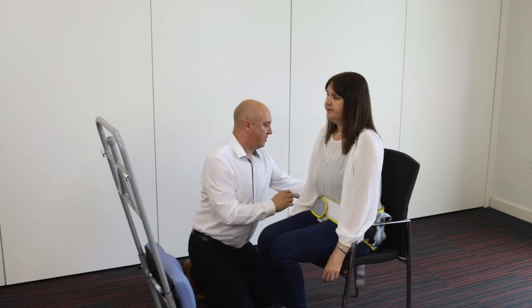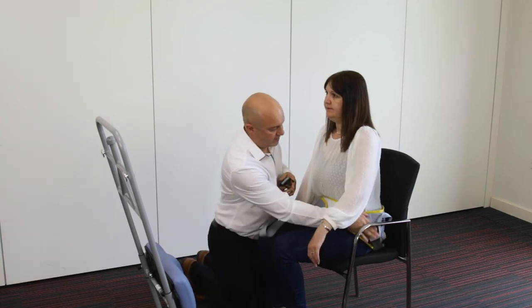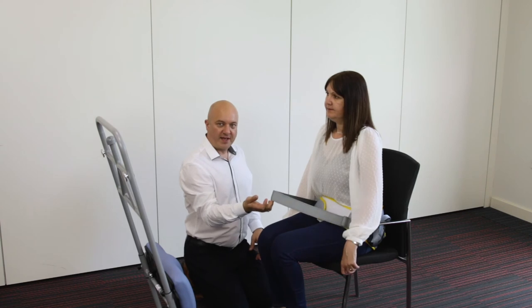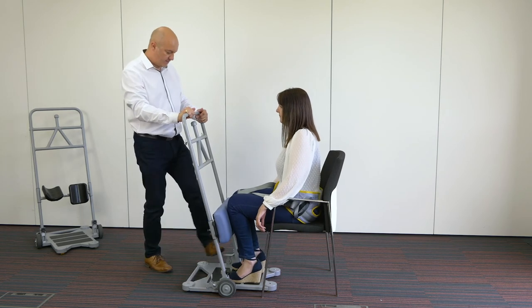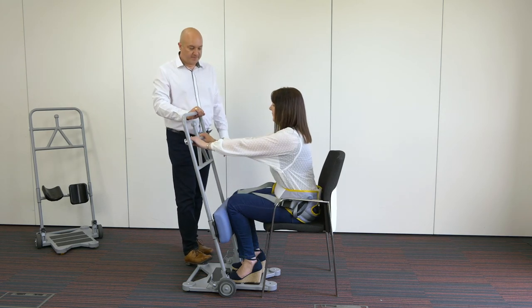Grab the long buckle fastening belt. This belt isn't designed to be tight and hold her in — it's designed to be as long as possible. Once we get Sarah standing, this is going to attach to the unit at the top and support her whilst she's stood up. So pop your feet onto there — the knee pad's already set from last time. Counterbalance again with foot and hand, and whenever you're ready hold on in any position and stand up.